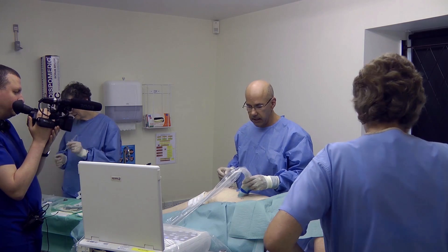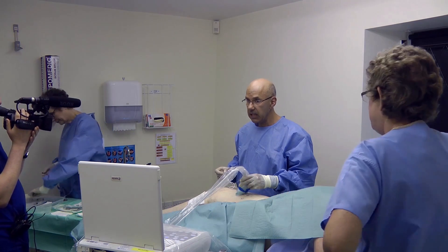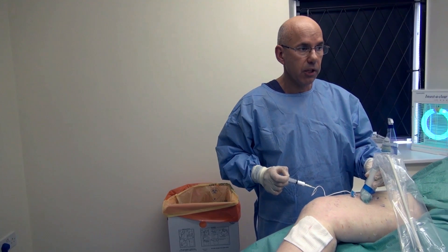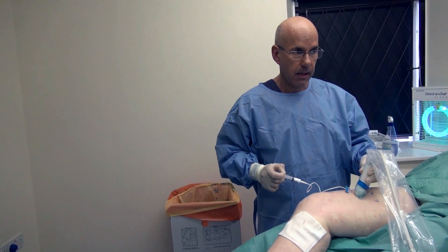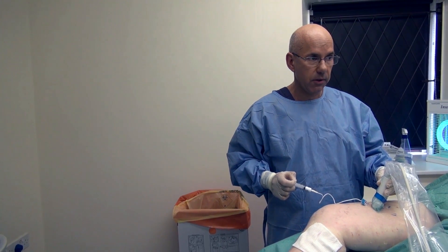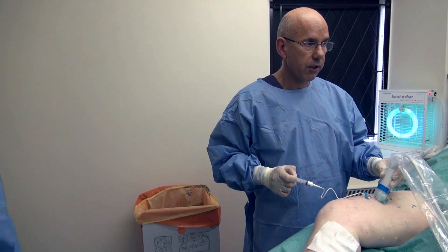The final criterion — and we are very, very cautious about this — is that we see the foam in the vein and also that the injection is painless. This should cause Carol no pain whatsoever, and we can see the foam going into the vein, confirmed on ultrasound.